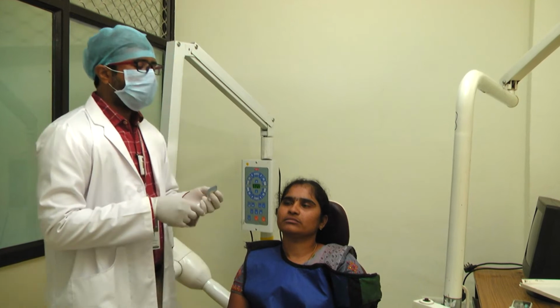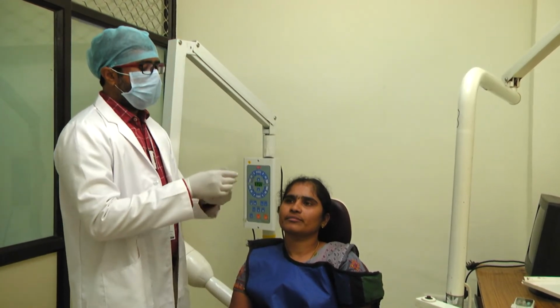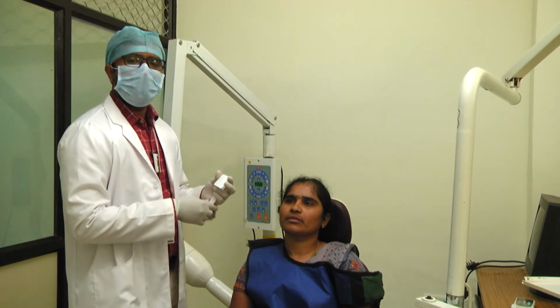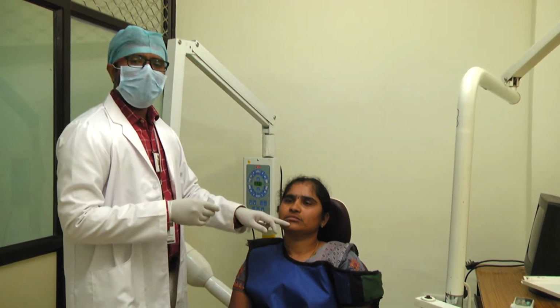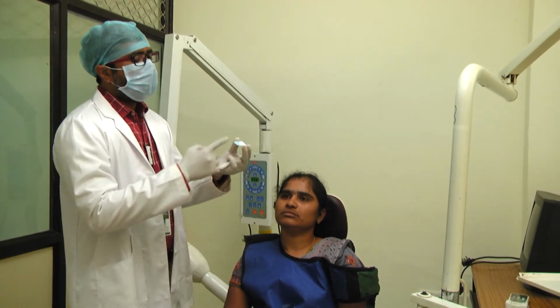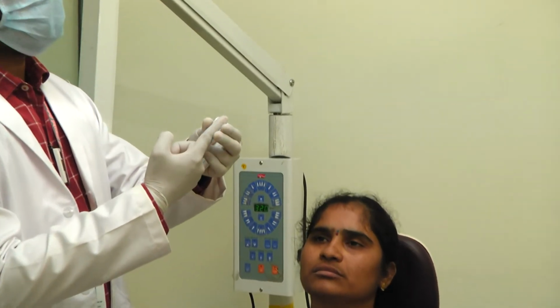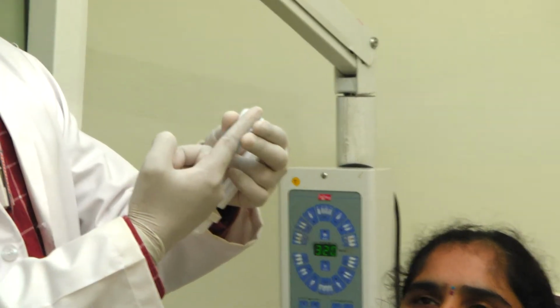And then for the mandibular central and lateral incisors. While placing the film for the mandibular central and lateral, since it is a very narrow arch, in order to follow that curvature, you slightly bend the film. While bending the film, just keep your index finger and slightly bend. So it should be an obtuse bend.